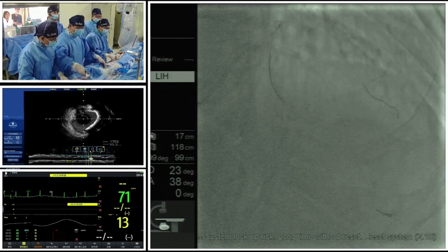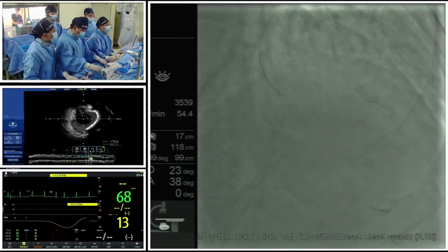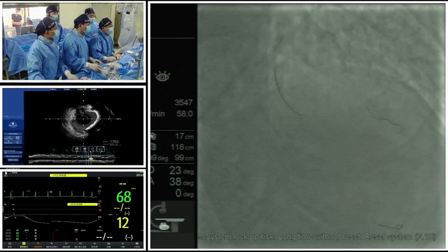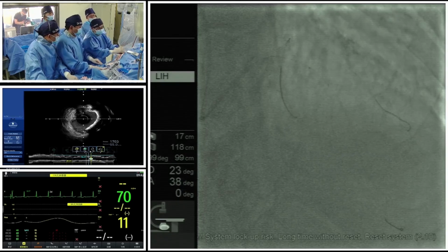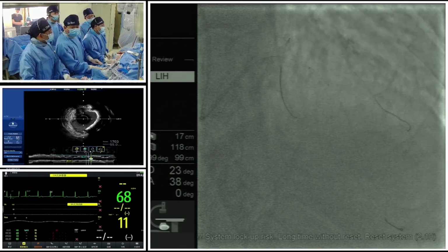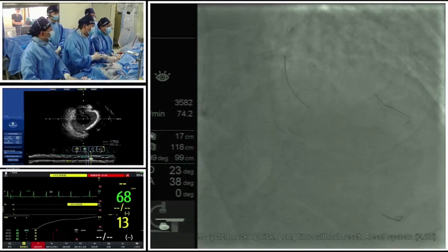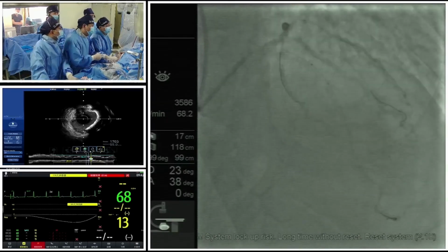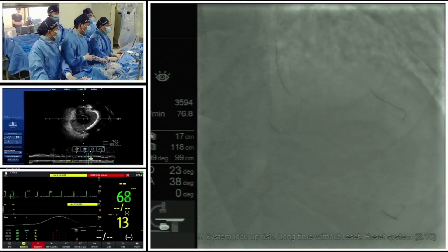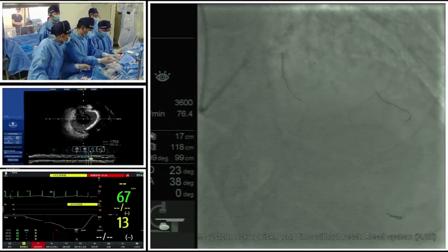As we see in the imaging result from the circumflex, the ostial calcification of the circumflex is also moderate to severe. We'll try the IVL pre-treatment. So you want to treat the ostium of the circumflex with IVL first? Yes, I will pre-treat first, because of the calcification at the ostium of the circumflex. So you are kind of worried that after you put a stent from the proximal LAD to the left main, there's a risk of the circumflex occluding, right? Yeah.